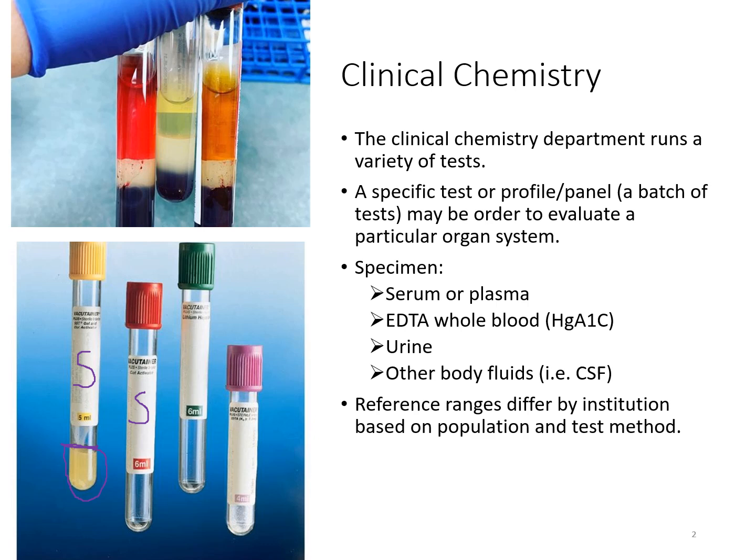Plasma is usually done off of a lithium heparin tube, and that's the green tube. And then your EDTA tube is only used for your hemoglobin A1C. Now, some labs may include this in chemistry. It's typically included in chemistry, but it could also be included with some of the other departments, like serology or hematology.